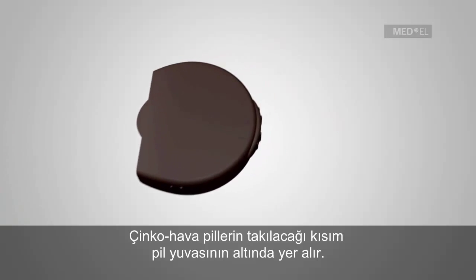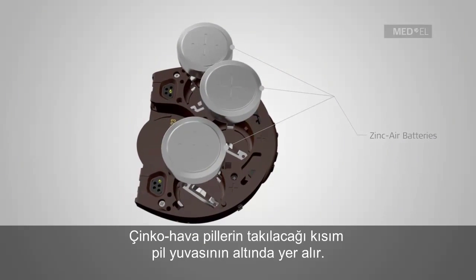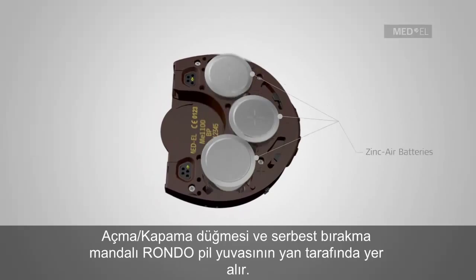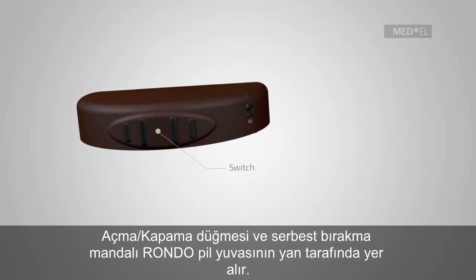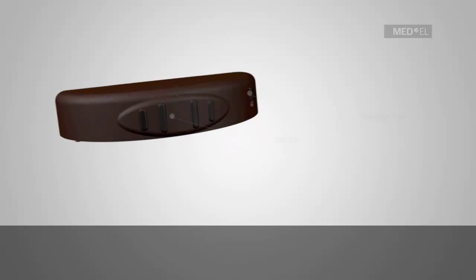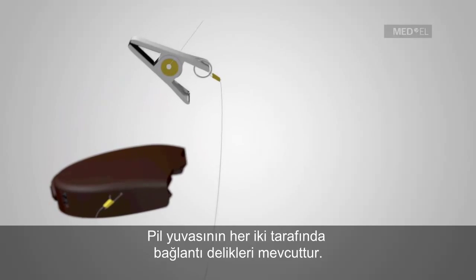Slots for the individual Zinc Air batteries are located on the underside of the battery pack. The on-off switch and a release lever are located on the side of the RONDO battery pack. Attachment holes are positioned on either side of the battery pack.